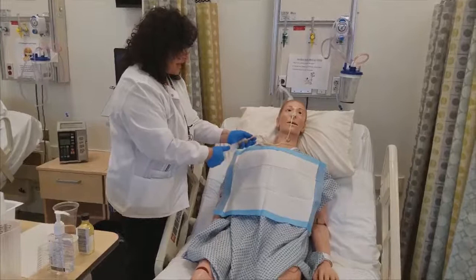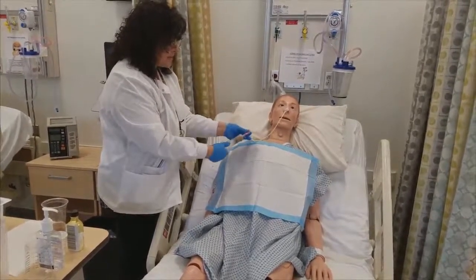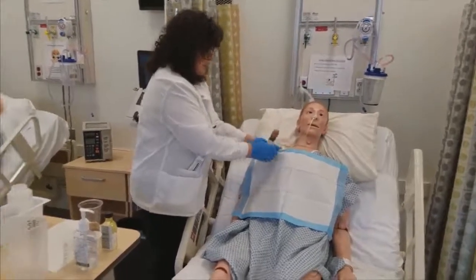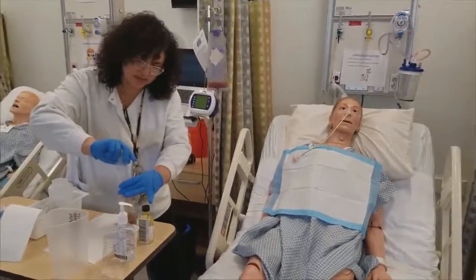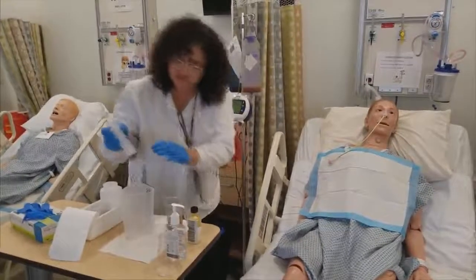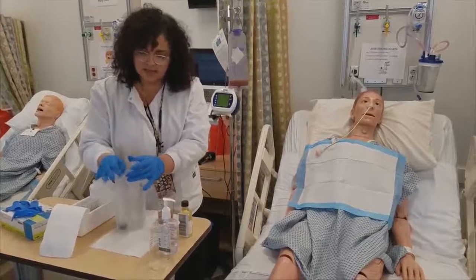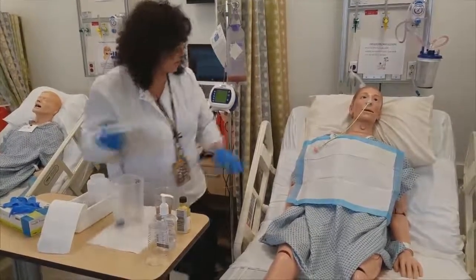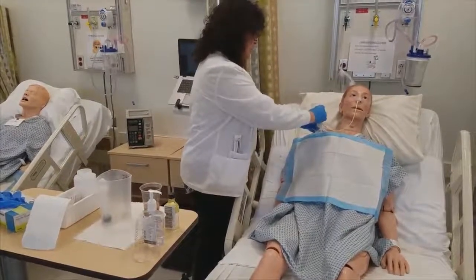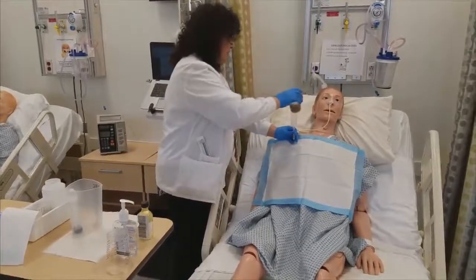All right, so we aspirate till we cannot pull anything further. So that looks like I have emptied the stomach at that point. I'm going to go ahead, clamp it up for a minute. I'll need 2 hands. And I see that I have 90 milliliters. My parameter is anything less than 250 is okay. So it looks like things are moving along just fine in the GI tract. So I can go ahead and give this back so that I don't cause fluid and electrolyte imbalance.